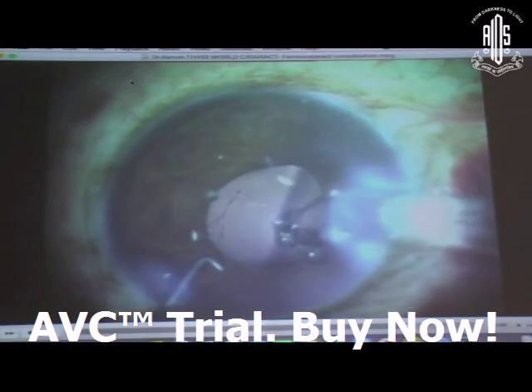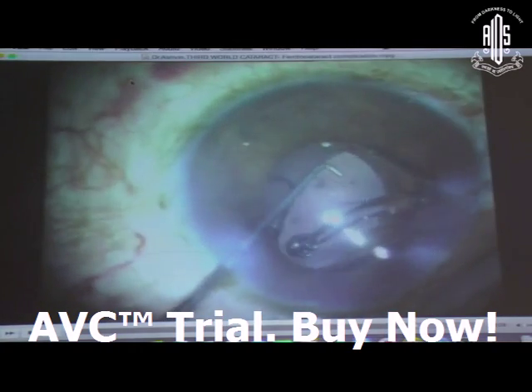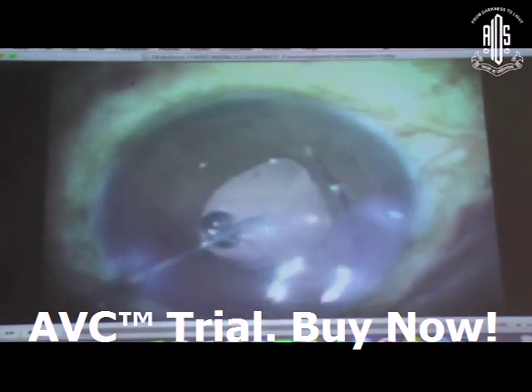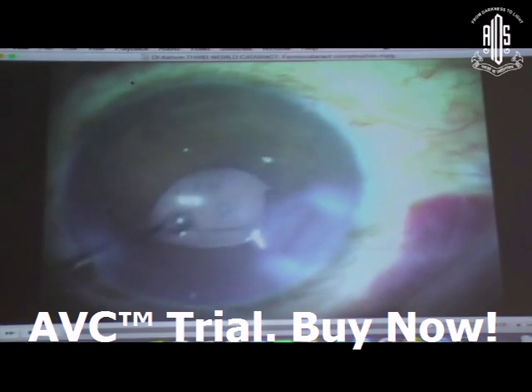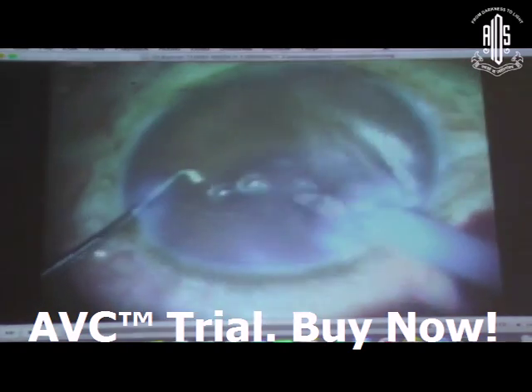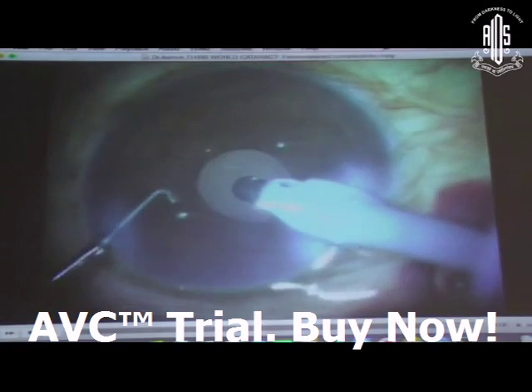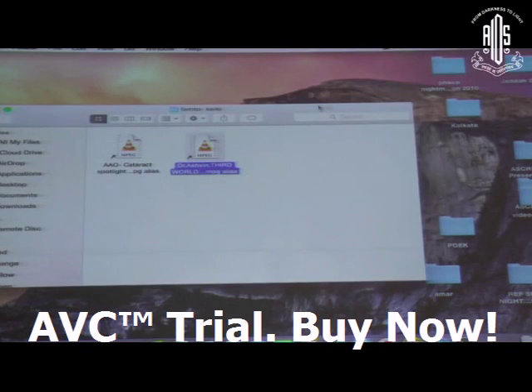Now one big problem which you'll have in femto is if you have a small pupil. If you have a small pupil, you cannot do femto. I was discussing this topic with Abhay also. You can put some ring, but the problem is the docking is going to be a headache. So either you tell the patient clearly, look, it's not going to happen, or alternatively, you'll be much better off just shifting to some other technique rather than telling him something or the other.